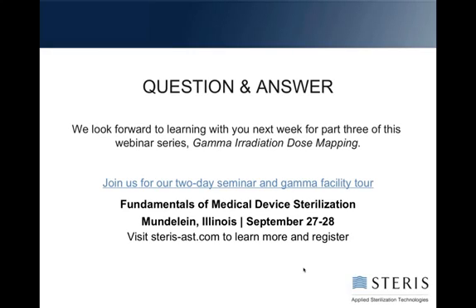Okay, the value of the recovery efficiency is to assure the accuracy of the bioburden number and directly to assure that the sterilization dose and verification dose are accurate. Most labs will recommend that you periodically repeat that test to assure that there aren't changes in your product, which could be the question. If I'm missing it, whoever put in the question, just email me so that we can talk it through. But I think those are the two areas that would probably relate to that question.